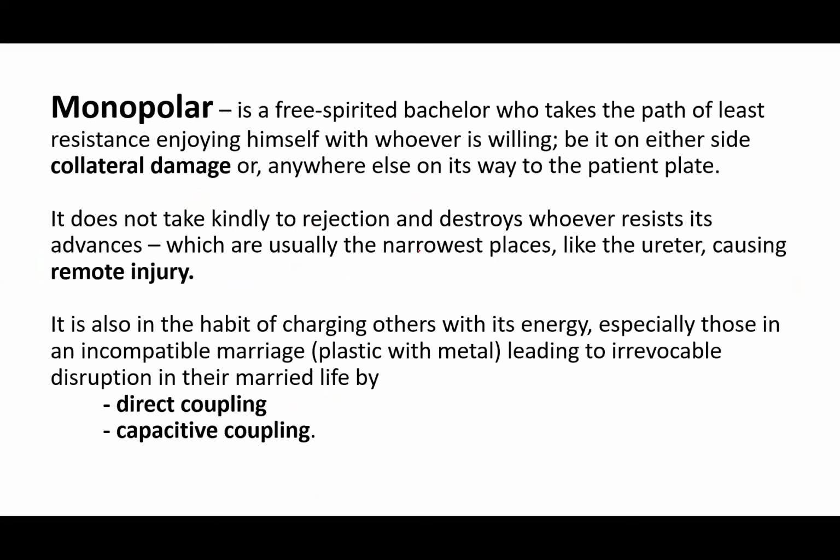Now, the monopolar. This is a free-spirited bachelor who takes the path of least resistance, enjoying himself with whoever is willing, be it on either side, causing collateral damage anywhere else on its way to the patient's plate.